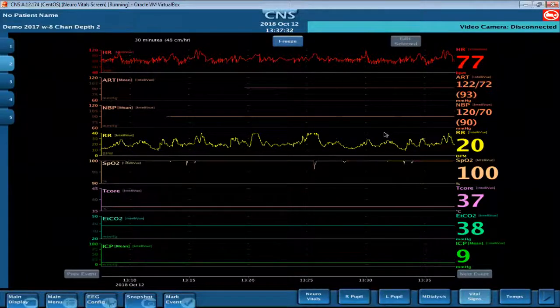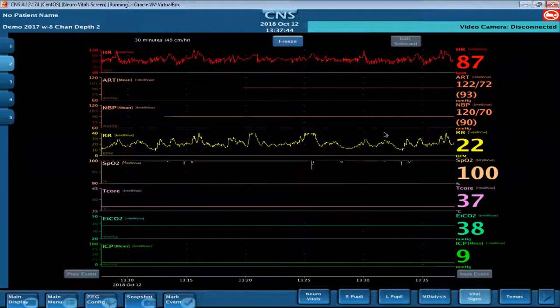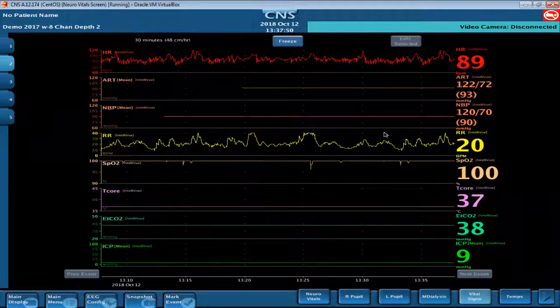Yeah, I like it for those times when, as the patient progresses or as you might be escalating care, you might want to add things. It can be flexible, and again, everything's being recorded. So depending on how you use your reader later, you'll be able to see all the trends, but at least for your display, it can be more flexible.